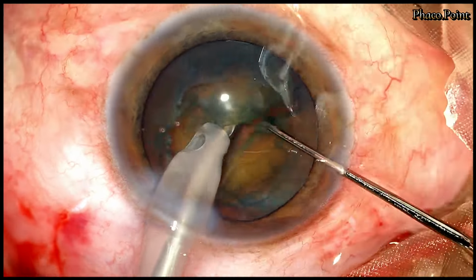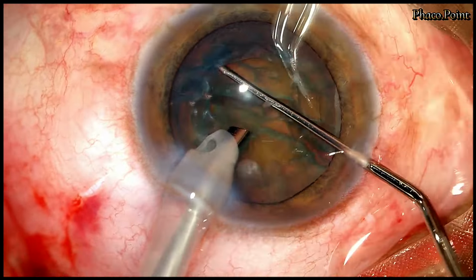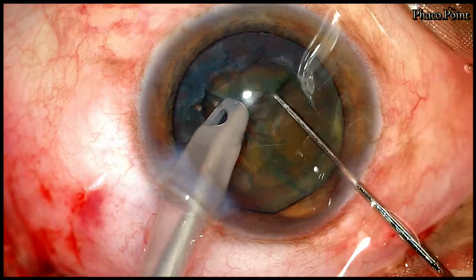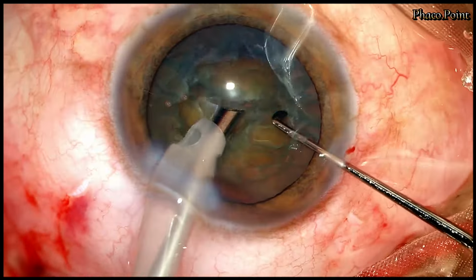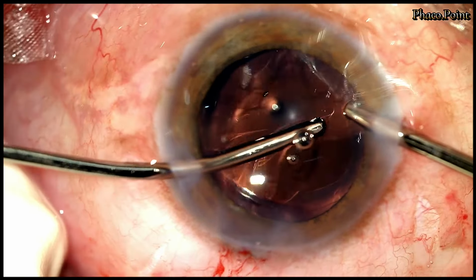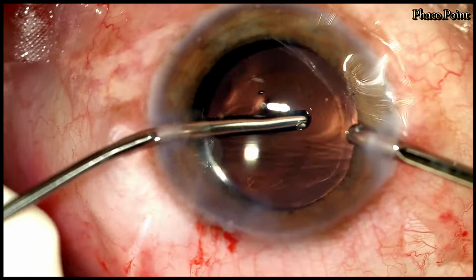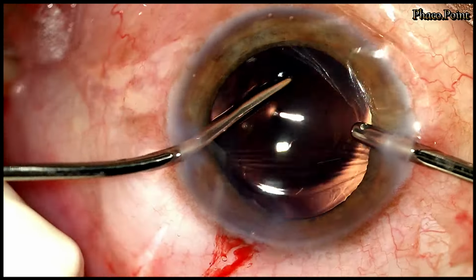Now, should this have been an extensive subconjunctival ballooning that had occurred as a result of a tear created at the limbus during the phacoemulsification procedure, you will find that having created a radial tear at the main incision will prevent any fluid from further entering the subconjunctival space, and you'll be able to carry out your surgery with ease.